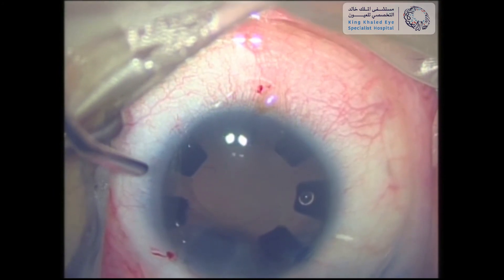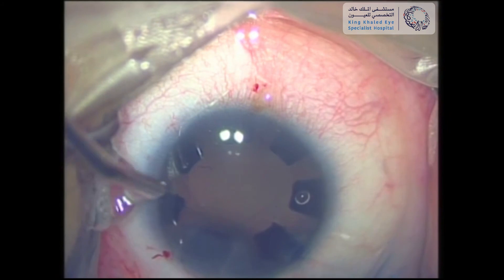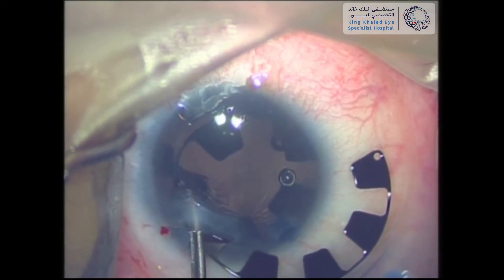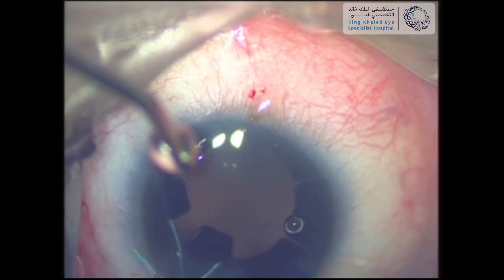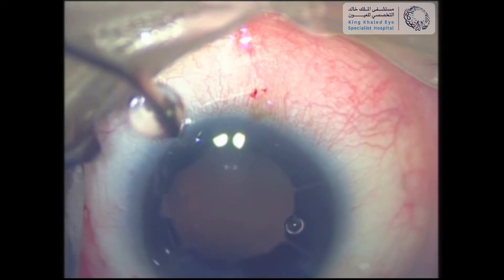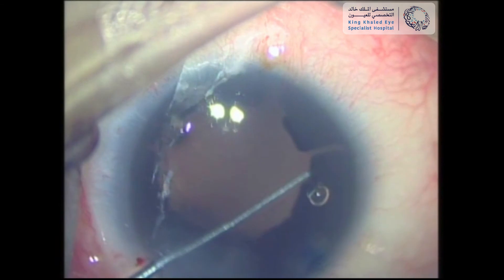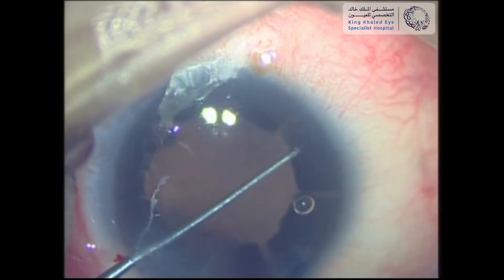The ring covers half the area needed, which is why in each case you need to use two ring segments. The second ring is inserted with the same maneuver as the first one, and it's dialed against the first ring to give us the final result, which is a totally closed diaphragm. As a final touch, both rings were maneuvered to make sure that they interdigitate properly, filling the gaps in between.